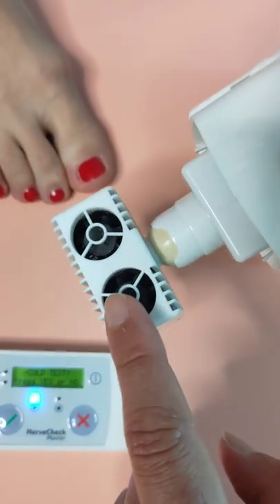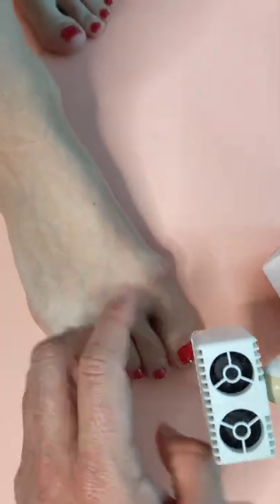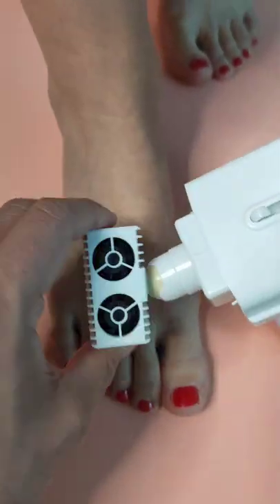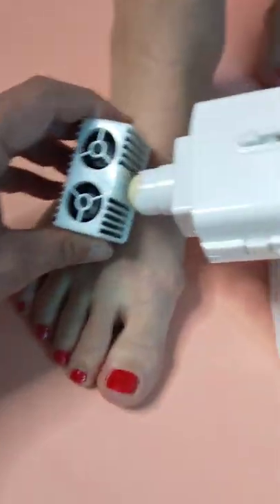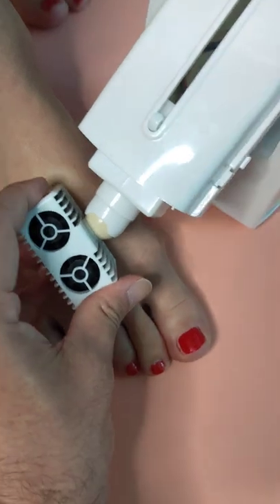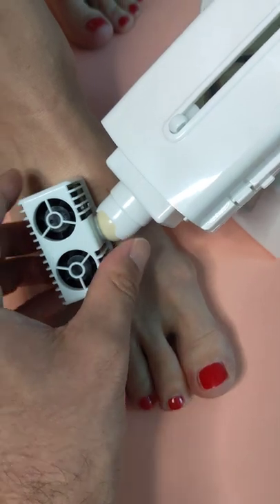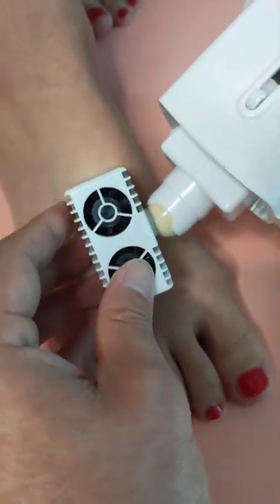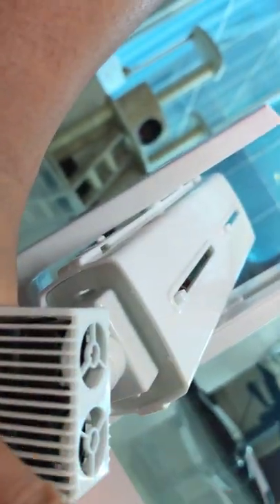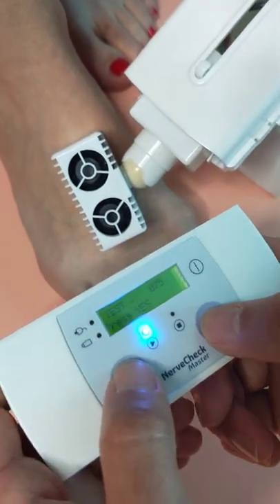For the cold test we're going to apply the sensor — this part of the surface — on this part of the feet. You rotate it and then lower it down and make sure that the whole surface of the sensor is touching the skin. Like that — as you can see on this side it's all the way touching the sensor. Now we're ready to do the test.